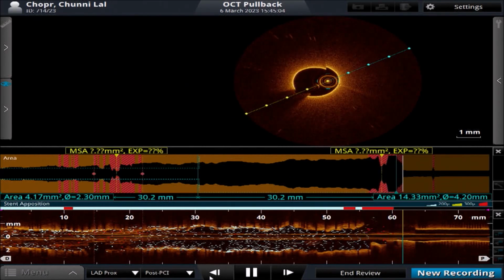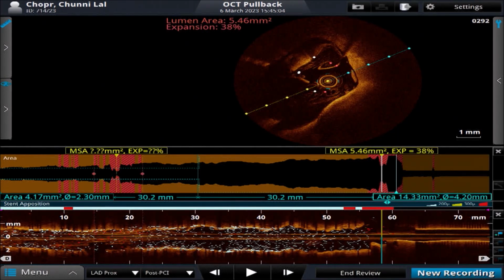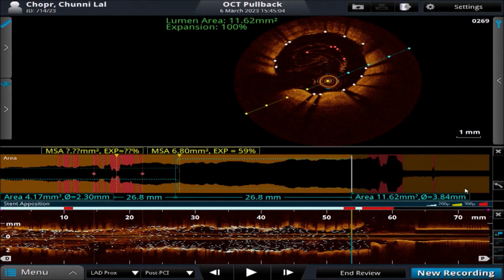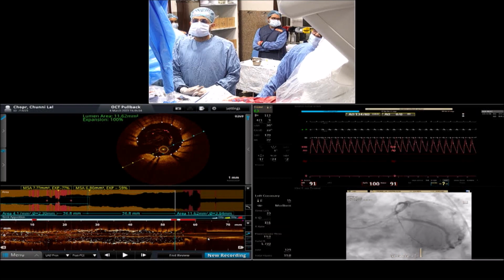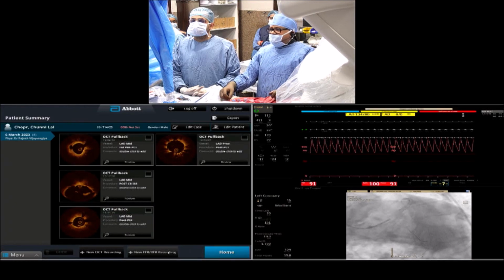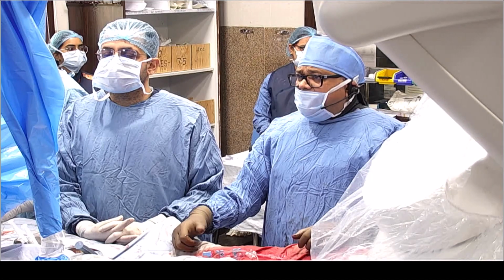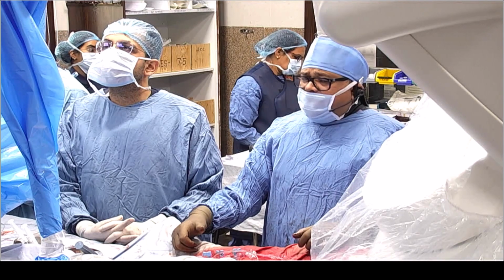And this is the left main. So we do have a perfect optimization across the whole of the LAD, with a good result. So here I want to stop without doing anything actively for this aneurysm. Let me have the regular follow-up of this patient. A follow-up CT angio can very well demonstrate the size of this aneurysm and also flow across the diagonal. If required, a graft stent can be put at this particular segment during the follow-up.